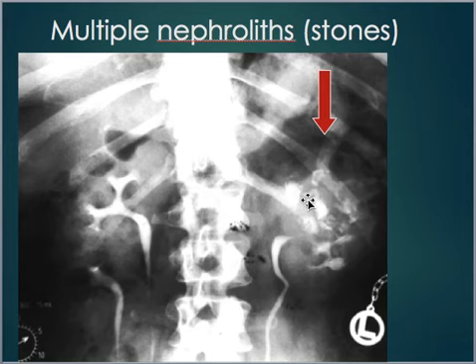This patient has a lot of little stones, so you can see one here, here, here. There's a bunch of stones throughout. A lot of people can have stones and not know it.